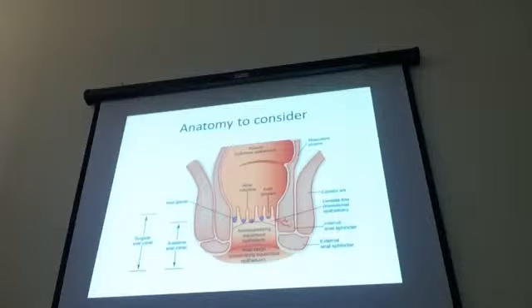And then the squamous mucosa here is non-keratinizing, but once you reach the anal verge, it becomes keratinizing. This is a slightly different origin than this, and the kinds of tumors will be different down here than they are up here.